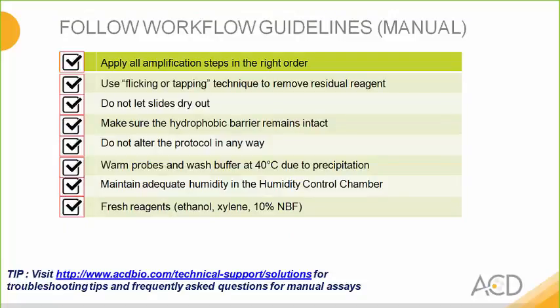It's important to follow the workflow guidelines when running the manual assays. And so here below is a quick list of the guidelines that you should be following, such as applying all the amplification steps in the correct order. Ensure that you're not letting the slides dry out, as this can affect the outcome of the assay. Do make sure that you're not altering the protocol in any way, and that you're following the user manual as is, and that you're reading the user manual per the assay that you are running.